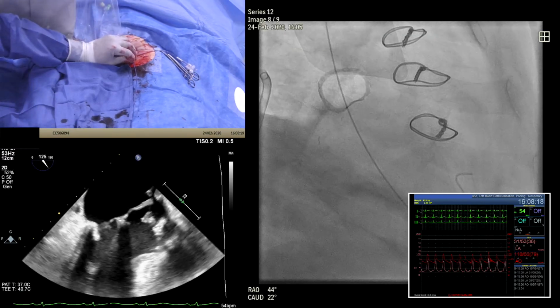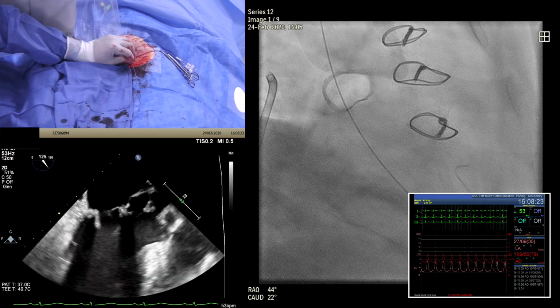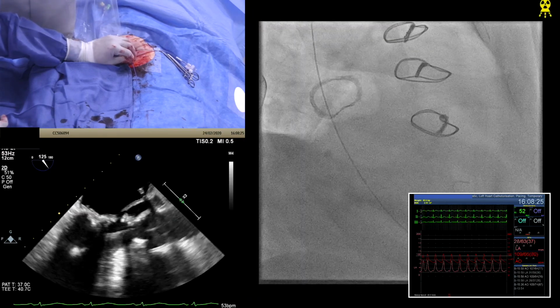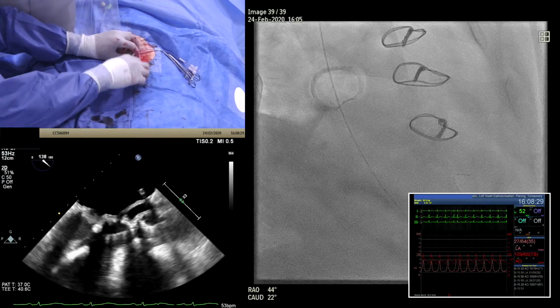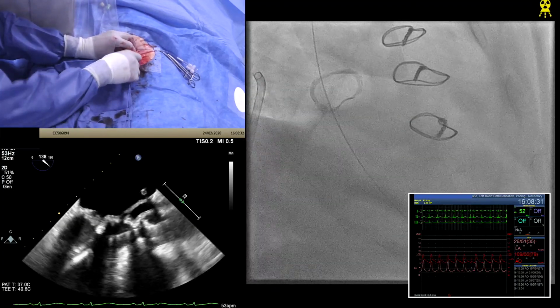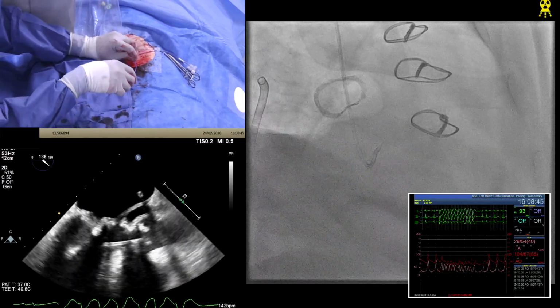Okay, so I can see where I want to be when I acquire, and when I'm just fluoroscopying, there's absolutely no hope of seeing that. Oh, I've got my eye in. Okay, so that's a maximum fluoroscopy, so we'll take the catheter through. Okay, VT again. Okay, hang on. So I'm pulling back. That will settle it down.